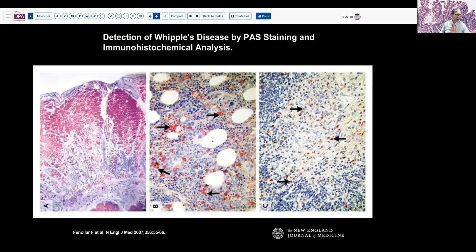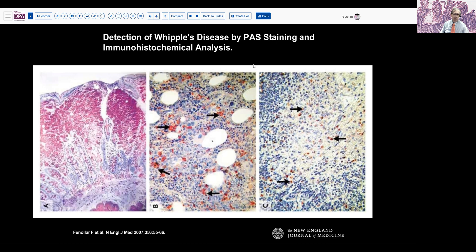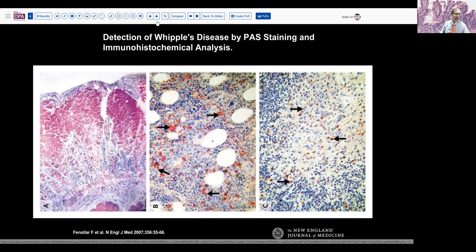Here's the classic appearance of the PAS positive staining in the macrophages — obviously this is a hard one to miss because it's so overwhelming. But these bacteria can also be detected by immunohistochemistry in other sites, here from the bone marrow using the specific antibody, and here in a lymph node granuloma. So those can be complementary and can be especially useful for retrospective evaluations as well. Unfortunately, this immunohistochemical staining is not widely available and validation materials are difficult to come by, so it's usually performed in a reference setting.